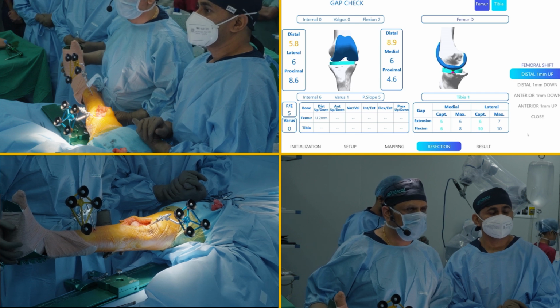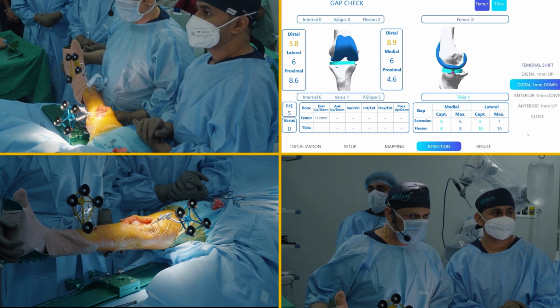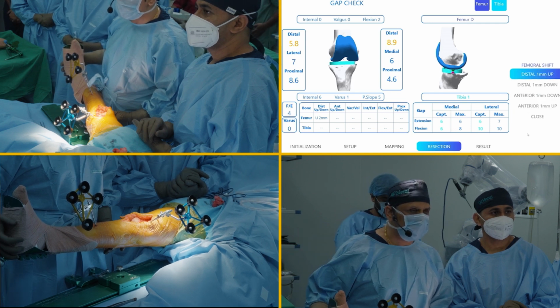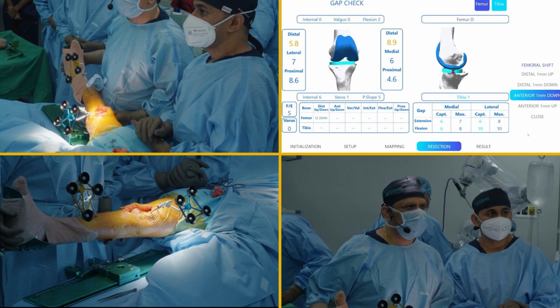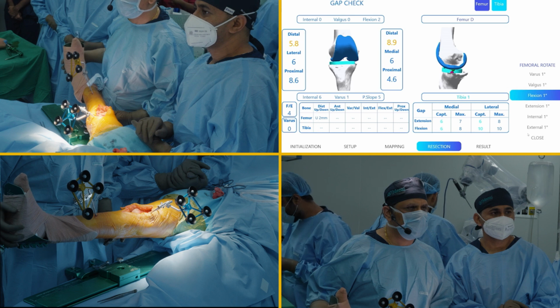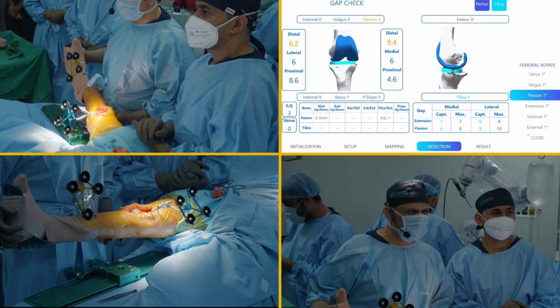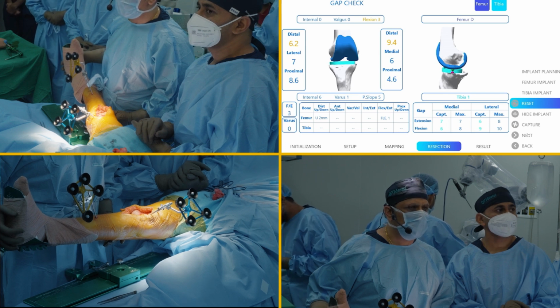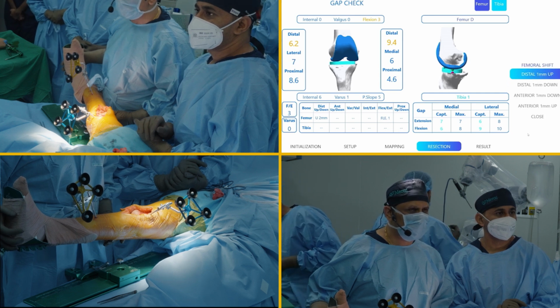Finish. Close. Femoral shift again. Femur close. Femur shift. Femur rotate. Close. Rotate. Flexion 1 more degree. Okay, finish. Close. Since I have given a flexion of 3 degrees to the femur implant, I am going to shift my femur implant component. Femoral shift. Anterior 1 mm down.